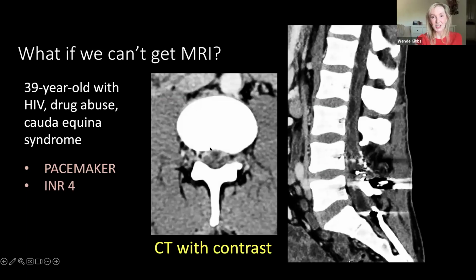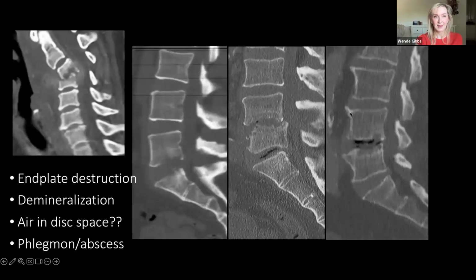But you could clearly see on this patient that epidural abscess, a big extensive abscess, just with the CT. Do you have anything, Mike? Anything before I move on? I wouldn't have picked up on the fact that there was a multi-segmental abscess there.